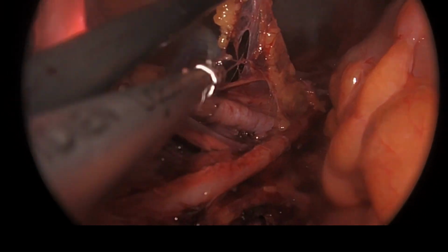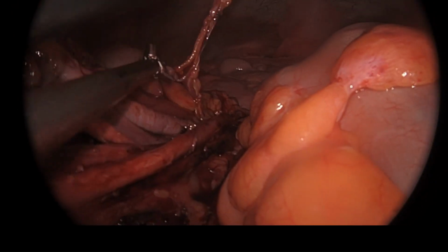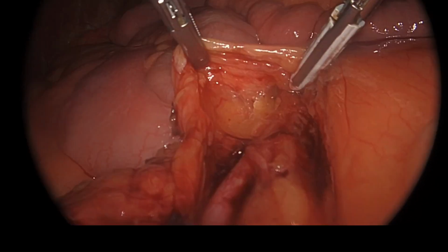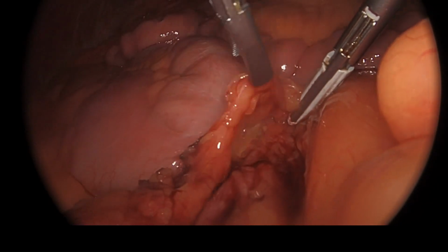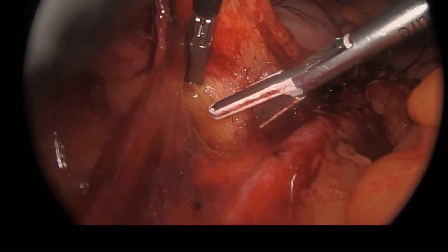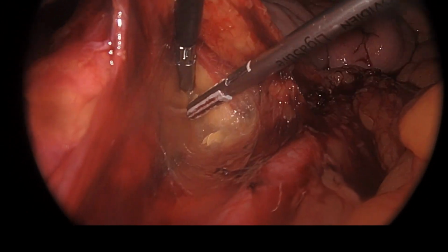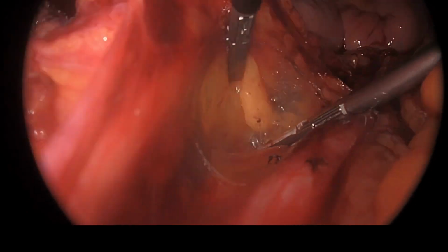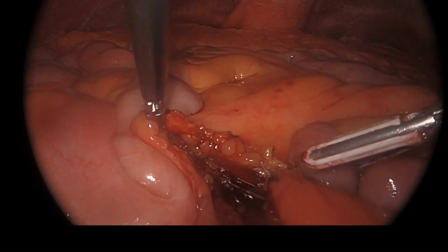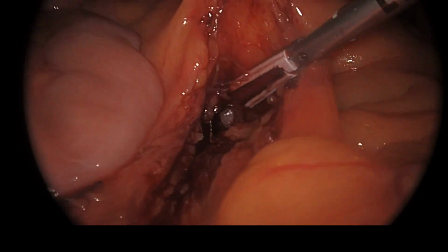Lower paraaortic lymph nodes were harvested using traction. The peritoneum over the arteries was incised, and areas for paraaortic lymphadenectomy were created. Because it was not possible to reach the area above the level of the inferior mesenteric artery from the vagina with surgical instruments, 5 mm suprapubic trocars were placed.